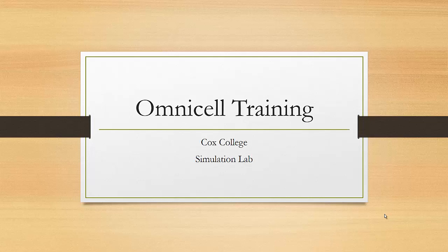I want to give you a little video instruction for utilizing the training Omnicell that you will have for your simulations. Please remember that this is to increase the realism or fidelity of your simulations. We don't want this to actually be your experience. So if you are struggling out at the Omnicell, please don't hesitate to knock on the control room door. Your sim specialist that is with your course will step out and assist you.